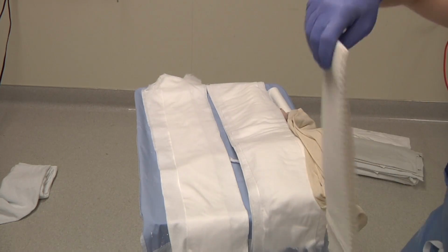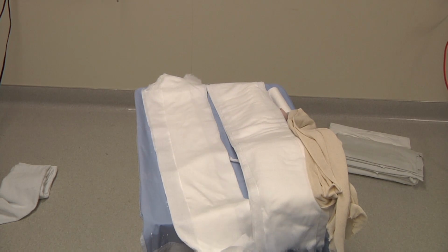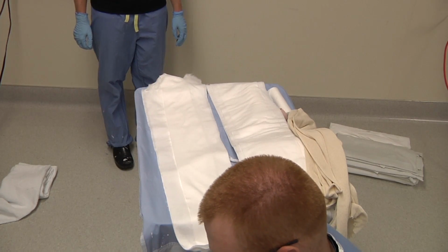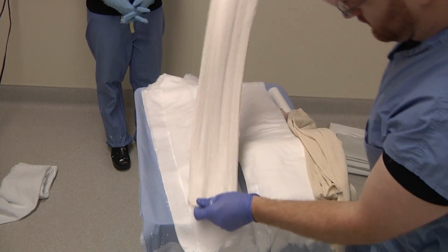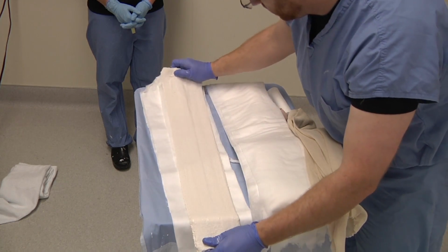We take our plaster and we dip it. Be sure to wet it thoroughly. Laminate thoroughly. We take and make our little plaster cotton web roll burrito.